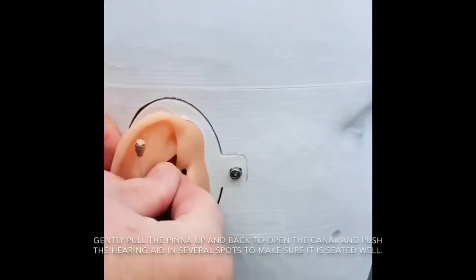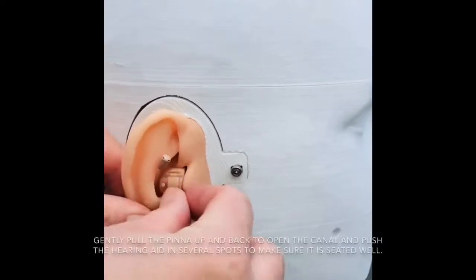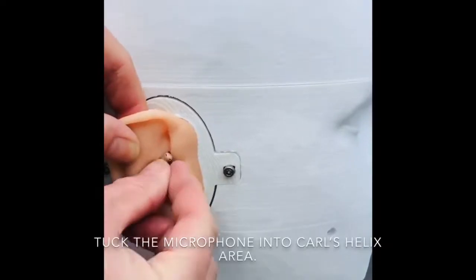Gently pull the pinna up and back to open the canal and push the hearing aid in several spots to make sure it is seated well. Tuck the microphone into Carl's Helix area.